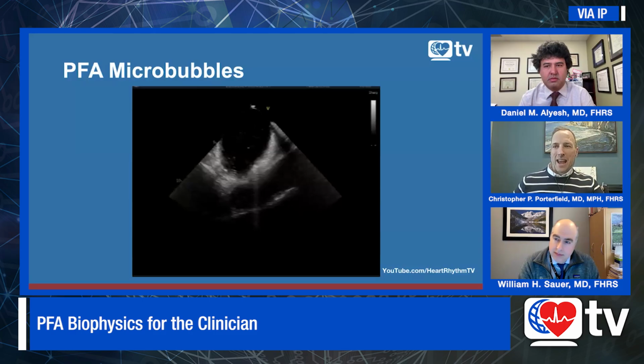I'm worried about catheter design. One of the issues that we see, and from more of a biodesign background that I have, it's the catheter-electrode interface that can cause arcing, can cause coagulum, and so I've seen it in vivo, and I'm a little worried about that part of it. So hopefully, as we get to second and third generation, we'll see a lot less of this. But that's kind of where I'm currently interested.